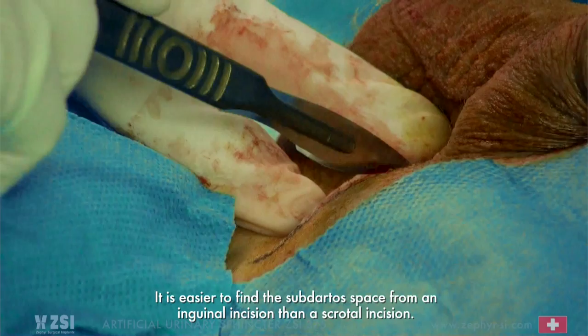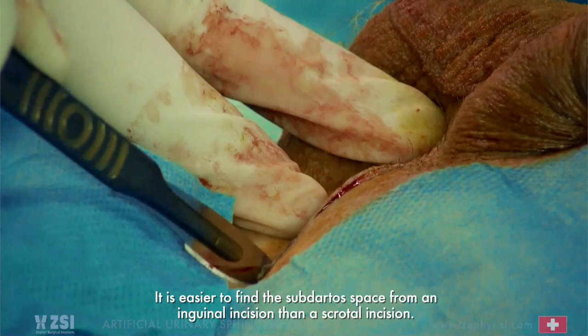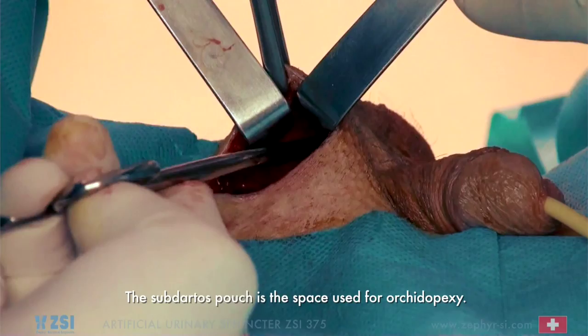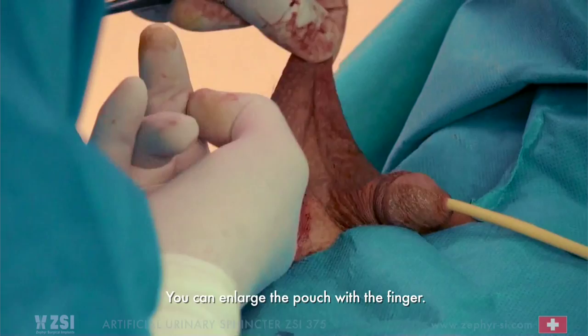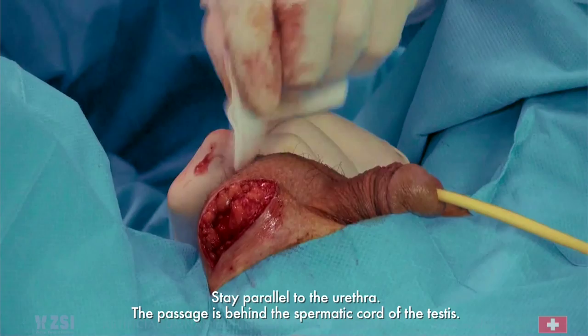Perform an inguinal incision. It is easier to find the subdartos space from an inguinal incision than a scrotal incision. Prepare a large pouch for the pump unit with the scissors and the Meyer clamp. The subdartos pouch is a space used for orchidopexy. You can enlarge the pouch with the finger. Perform the passage between the perineal incision and the inguinal incision, staying parallel to the urethra. The passage is behind the spermatic cord of the testis — help the fingers to pass through the tissue with the aid of a gauze pad.